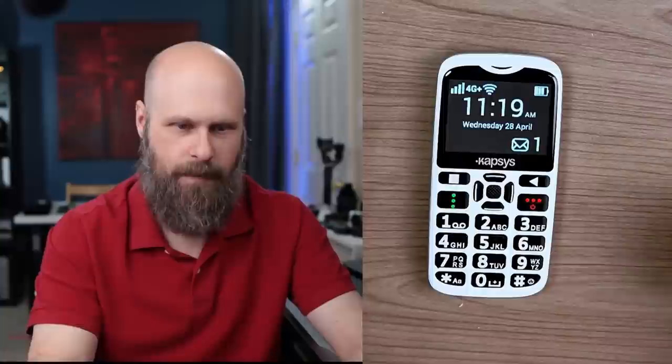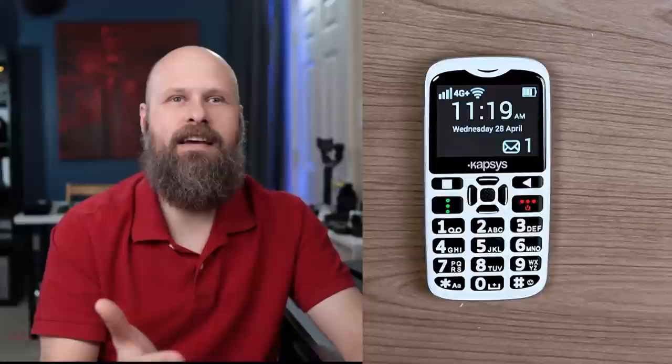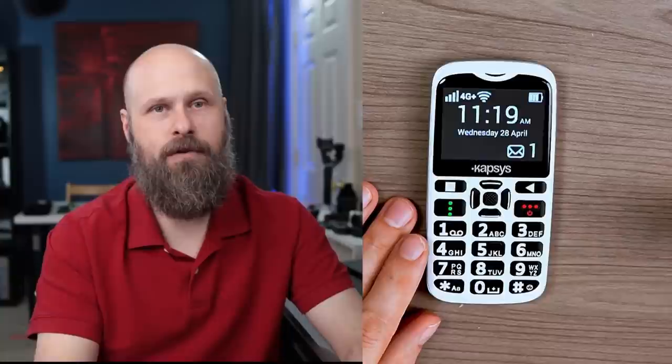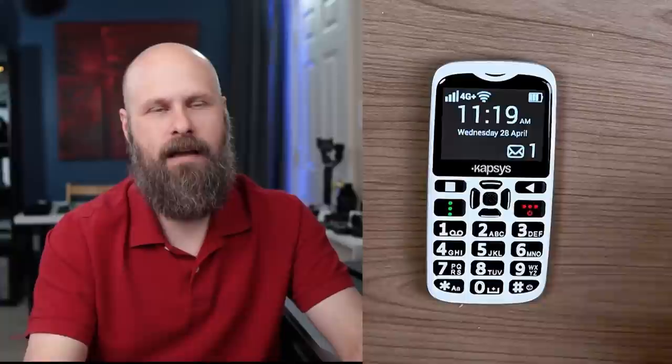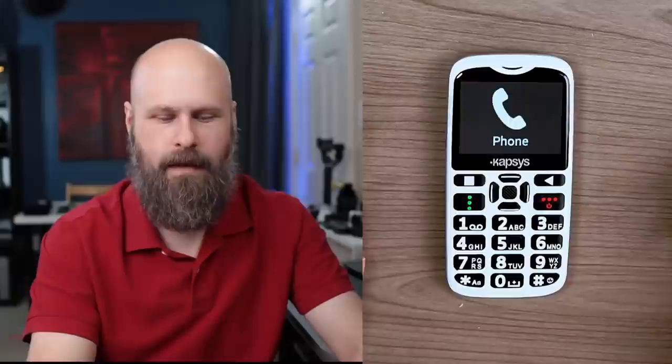The phone has a built-in simplified digital assistant — separate from the screen reader — that lets you give voice commands to perform functions. You activate it by long-pressing the OK button, and you'll get a prompt to speak after a beep. It works okay, though there is a little learning curve. For example, saying 'Open camera' wasn't understood, but simplifying it to just 'Camera' worked.